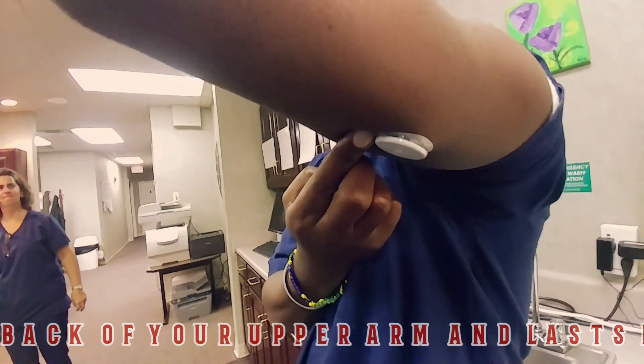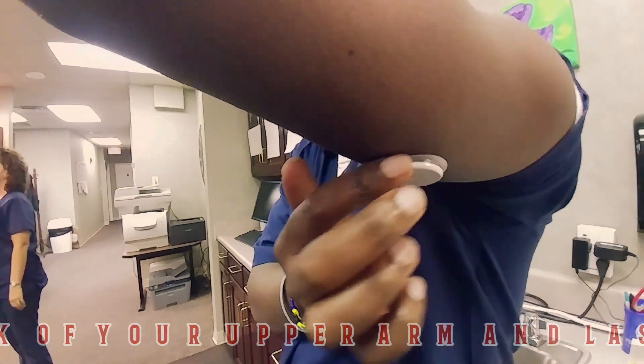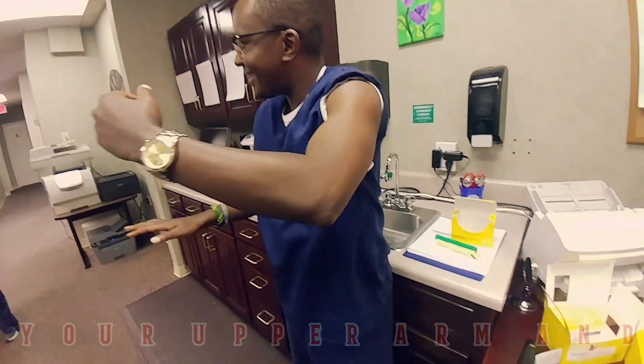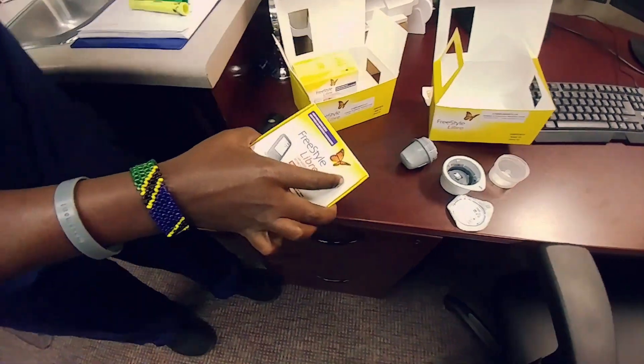Run your finger along the tape to make sure that it stays, and then just press right in the middle. There you go. Done. And so now Sabas is going to set up the reader.